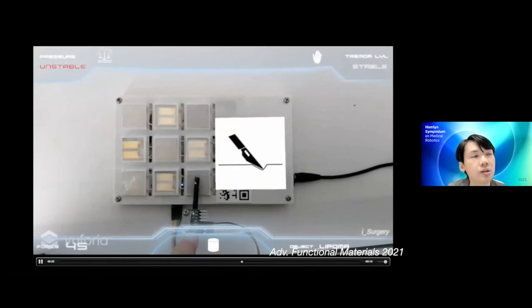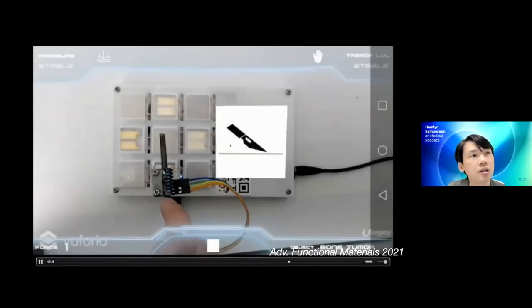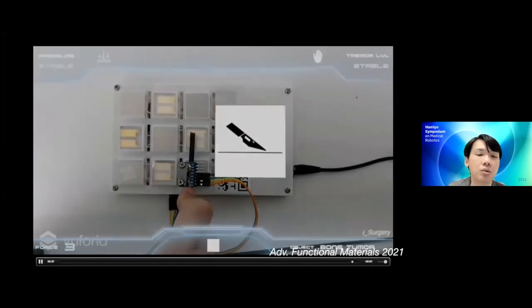the surgeon depresses the material, underneath the material is a pressure sensor. You can actually see how much deformation is being achieved, and also whether you're holding the scalpel steadily or not, right? So there's some use there. Beyond just going to the body, you can actually train the surgeons better, a lot easier than using cadavers, before they move on to more expensive training procedures like using cadavers.